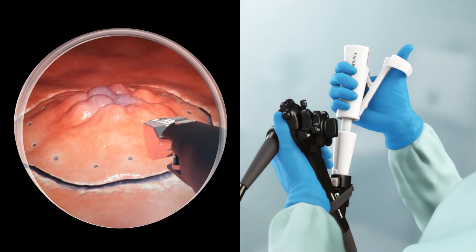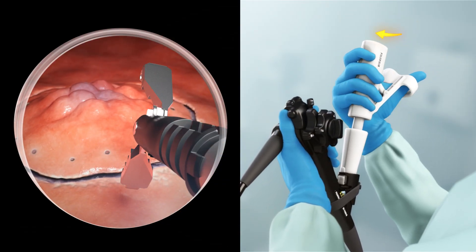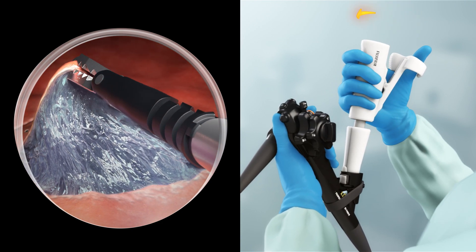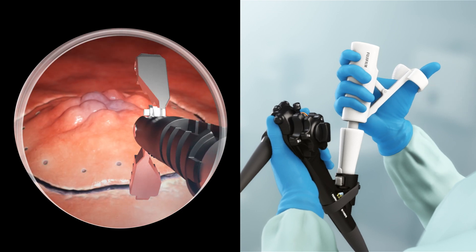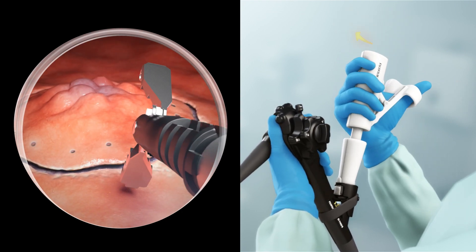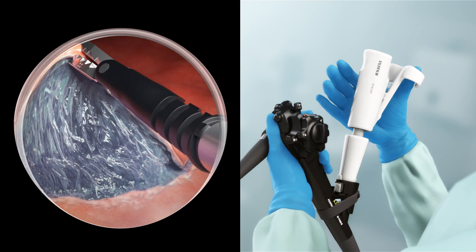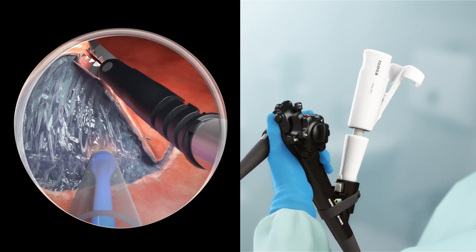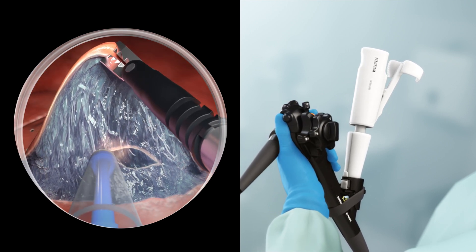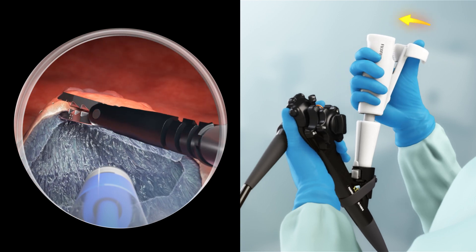Track Motion's intuitive design allows the physician control with simple single-hand movements, controlling the distal end independently of the endoscope's movement. Track Motion's unique 360-degree rotatable jaws easily grasp and re-grasp to expose the submucosa, offering enhanced visualization. Track Motion also provides stability and retraction without complicated locking mechanisms, making manipulation of the tissue easy and efficient during advanced procedures.